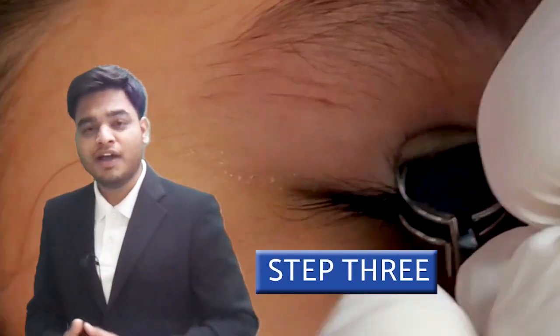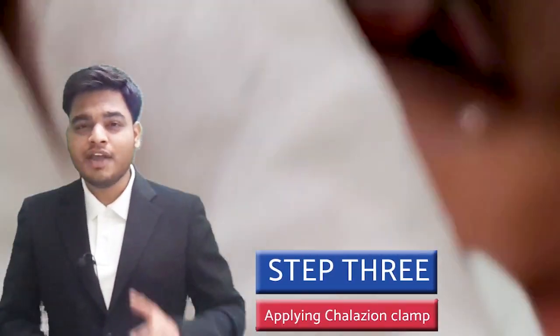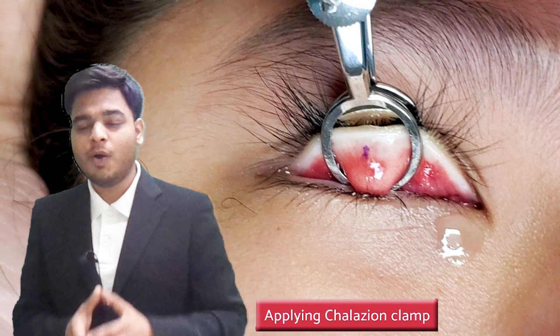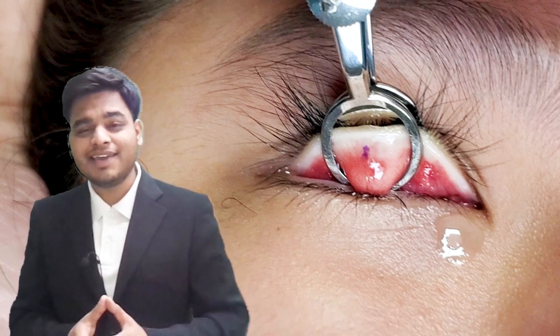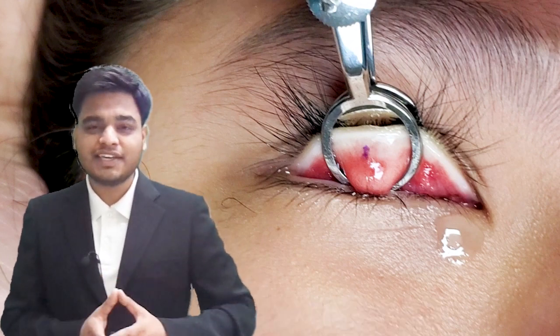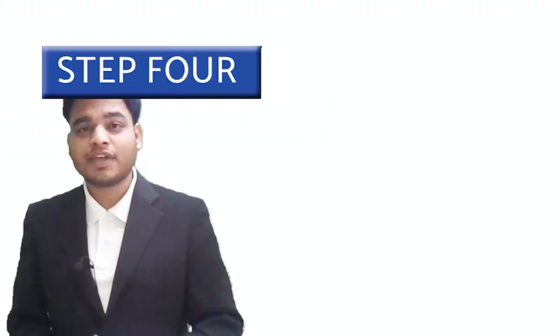Step number three: after achieving local anesthesia, we apply the chalazion clamp over the lesion. The eyelid is everted so that we can see the conjunctiva and tarsus.